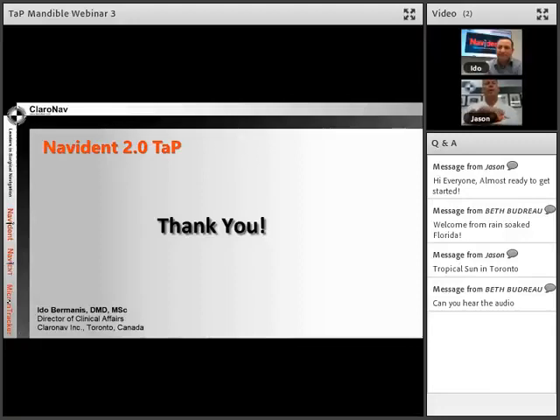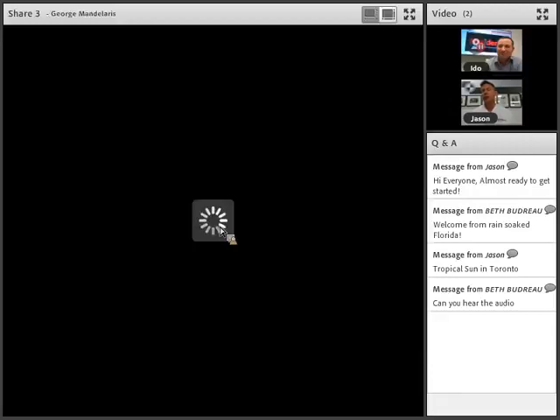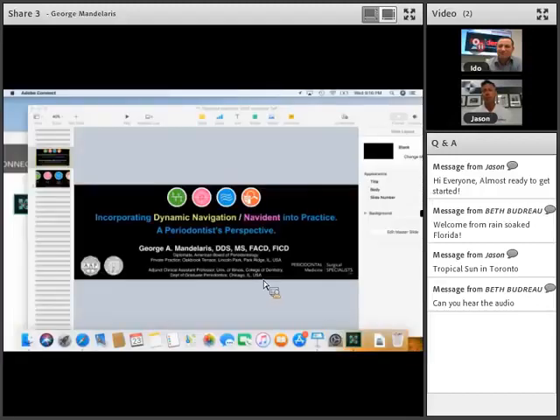Thanks, Tito. I appreciate it. It was a really, really great video, and along with our maxilla video, those are both going to be available on our website, on the main page of our website, as well as the first webinar. So both those videos will be very complimentary to your learning. I see we have people online right now who are beta testers and master clinical trainers, and other people who have the software and the system but limited experience with it. So these two webinar videos and these 3 webinars all together will be a really nice resource for you.